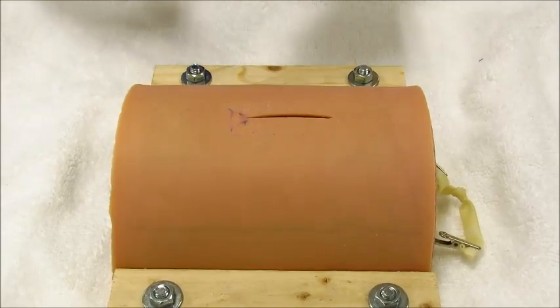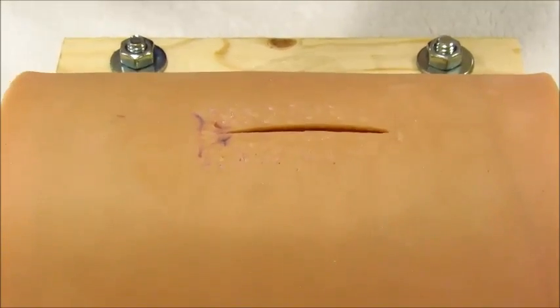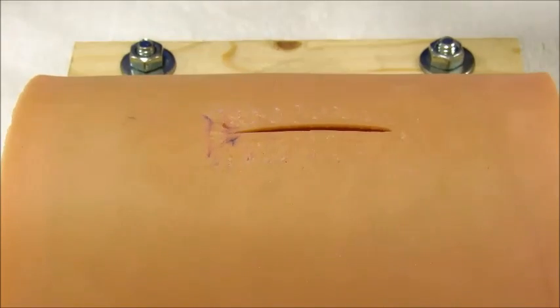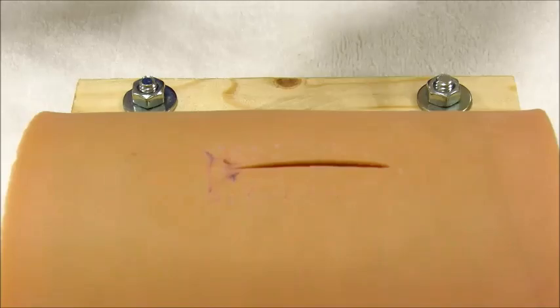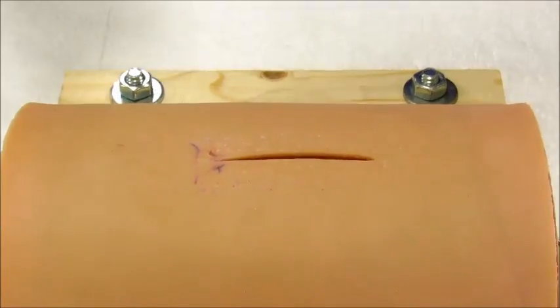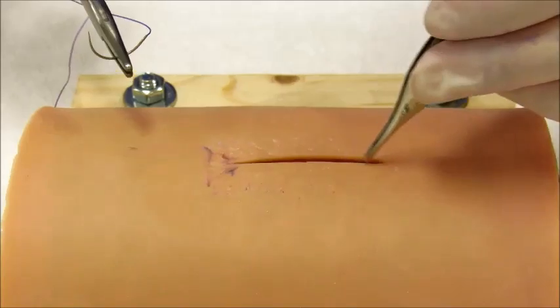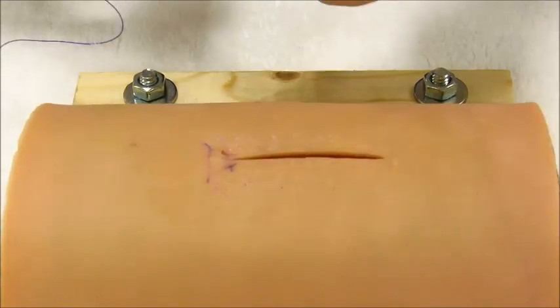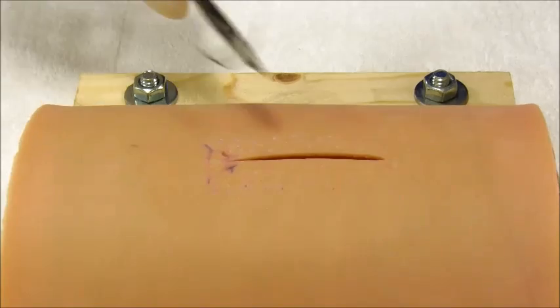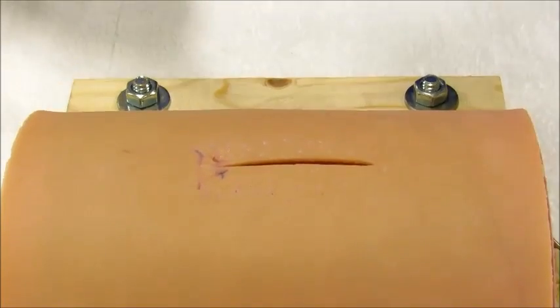So the pattern starts very similarly to how you start your intradermal pattern, where you're going to bury your knot. Instead of thinking superficial to deep, you're going to think of the incision being deep and away from the incision as being superficial. For this pattern, it's always performed parallel to the incision, so that's how you take your bites.